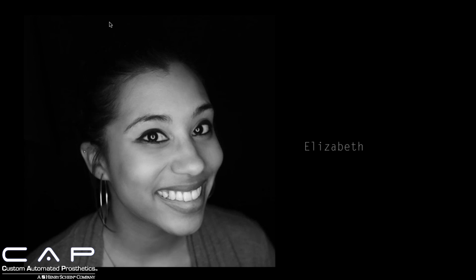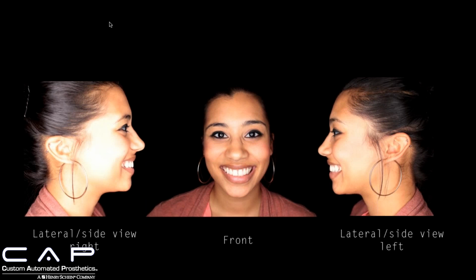And so that's a lot of fun too, because I think that basic portrait photography is really important in your shade taking as well, because it's not all about the teeth. It is, but it's also about the lip line, the smile line, the shape of the patient's head, skin tone, the whites of their eyes, all of these things.